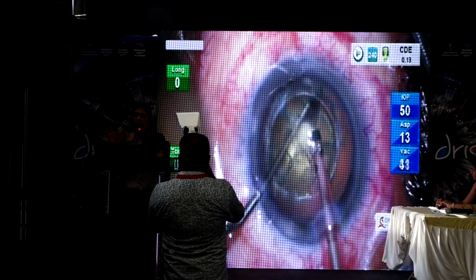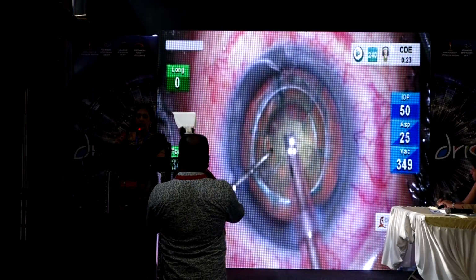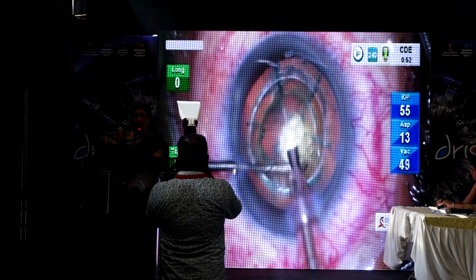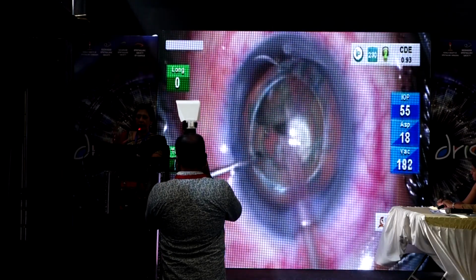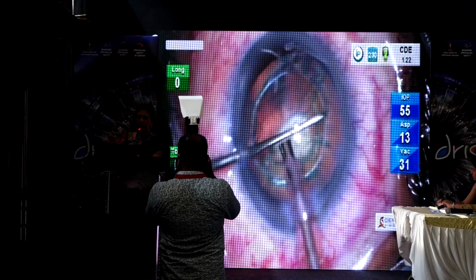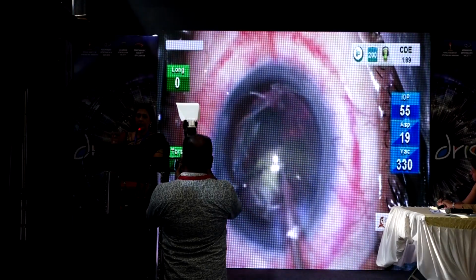So now all that is going to be done is separating these pies which have been created by the segmentation, and just chew it up with the phaco so that one level of the tire is eaten up, and keep going layer by layer. But all along your posterior capsule is not impacted by any of the intracapsular pressure changes which are occurring with the phacoemulsification. As you can see, the parameters are also kept at a fairly low level. And finally, all that you have is just one epinucleus cushion, and that also very easily gets folded up.